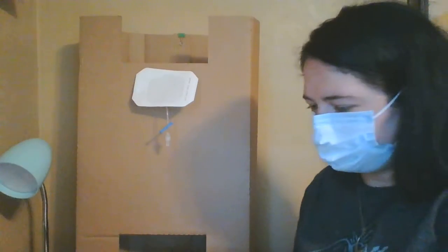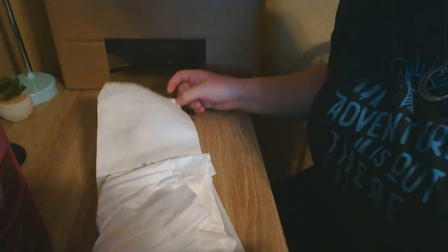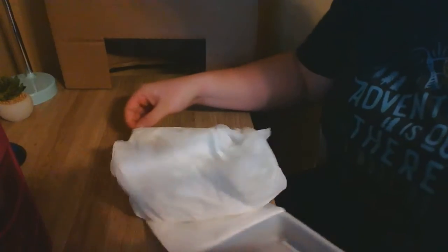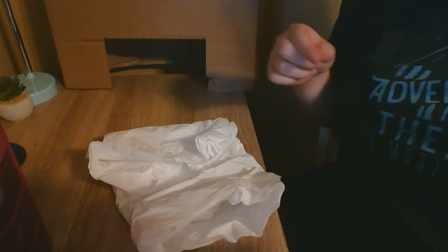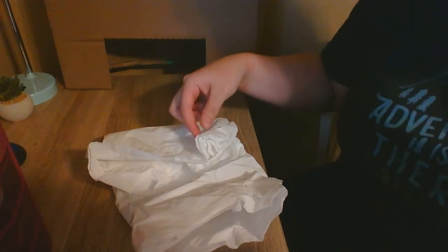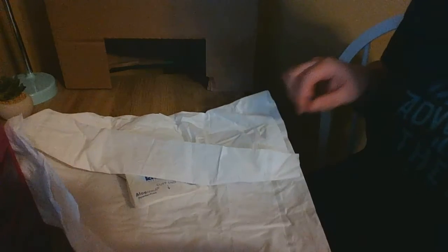So I have my kit here. So I'll just open my kit and go ahead and place my sterile field. Put this off to the side. I'm just gonna try to open my field very meticulously.